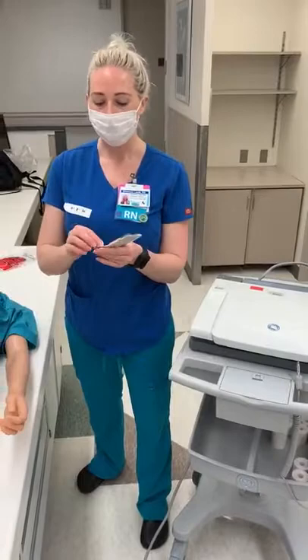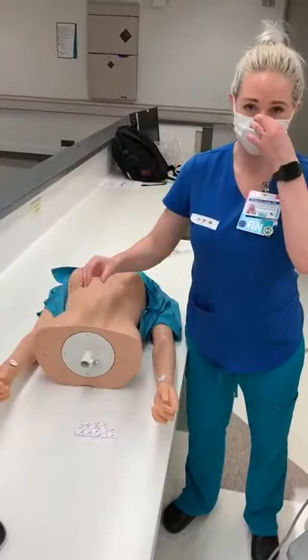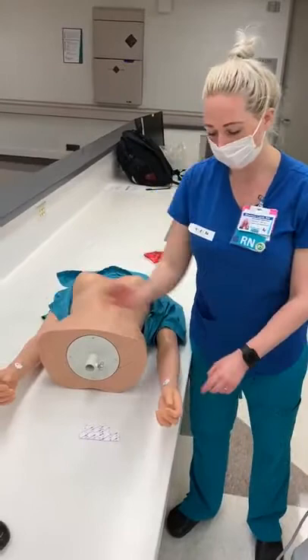I usually put my limb stickers on first because I know that they go on the arms and the legs. Ideally, we put these stickers on the patient's wrists and ankles. We want to put them as far away from the heart as possible so that we can get as big a picture of the electrical activity as we can. We don't want to put the stickers on any bony prominences, any dressings, or over any areas where the skin looks different — if they've had a burn or something like that. We want to make sure it's nice soft skin and we're not putting it over any tendons.